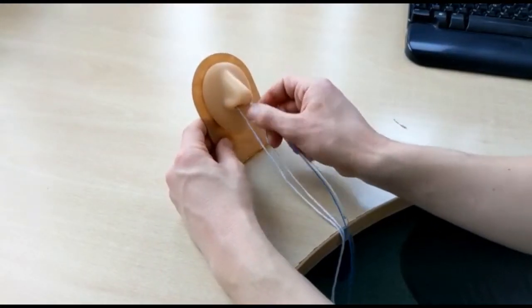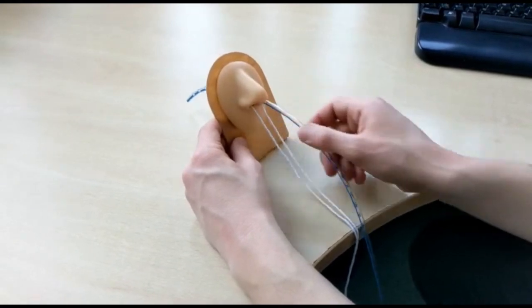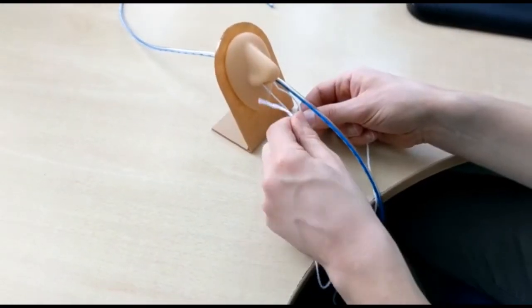Now you can insert the NG tube. It's easier to insert the bridle before the NG tube as the NG tube can be obstructive to bridling.